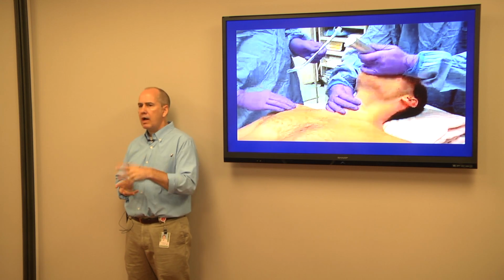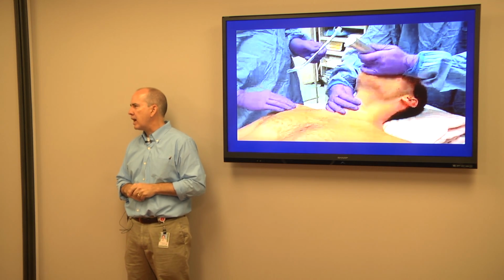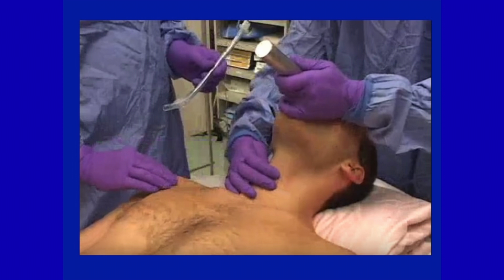So please make that a habit. Laryngoscope in your left hand, right hand on the neck. It will help you so much. Previously described was what's known as the backwards, upward, rightward maneuver. So similar thing, hand on the trachea, backwards, upward, rightward. It's moving it how you can see. Questions about that? I think it's a critical point to safely intubate.